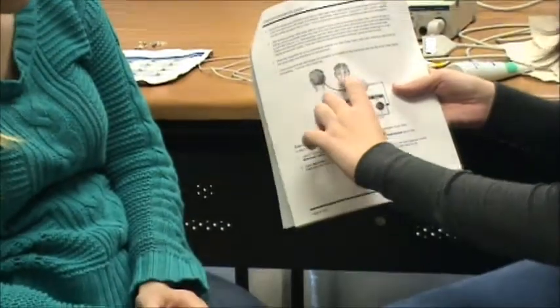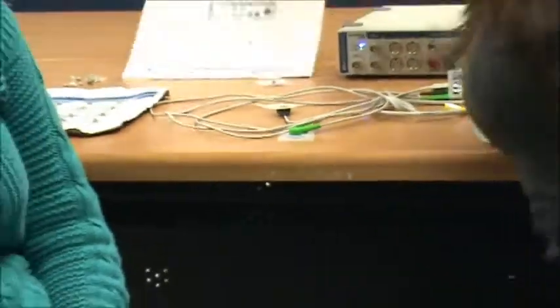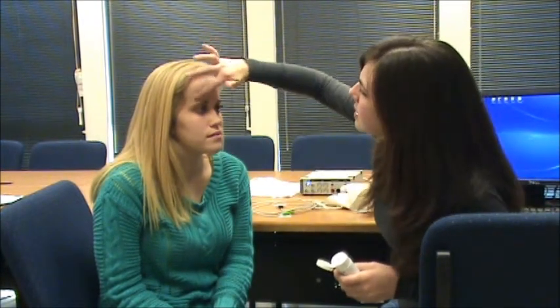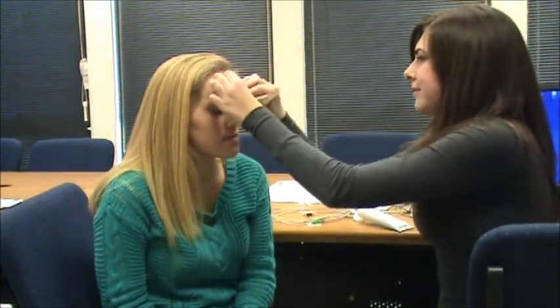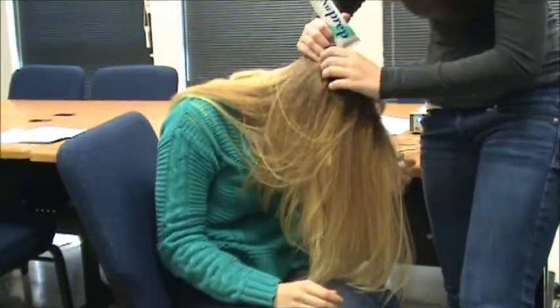Then our third lead is going to go over the right eye. Next we're going to put on this abrasive gel that's going to rub off any makeup or dead skin that's going to get in the way and interfere with the EEG. Wipe off any of the excess. Also don't forget to do the spot in the back of the head — somewhere right around the bump in the head would be fine.